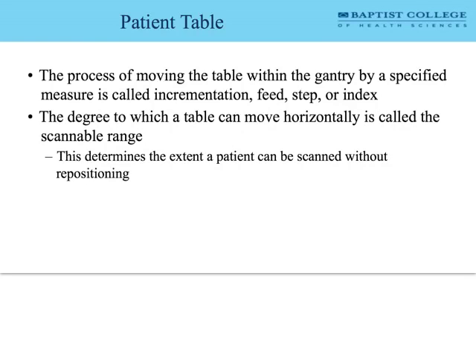But there's laser lights that converge on the patient. You can turn on the lasers, instruct the patient to close their eyes. I'm going to turn on some lasers, right? No one needs to be staring at lasers. You will then be able to see in 3 different directions where that ISO center is. So along the z-axis, along the y-axis, and along the x-axis, I can say the 0 point is right there. If I had a smoke machine, I could walk into the room and blow a lot of smoke in there and see right where all those lasers converge. That's what I'm lining up. I'm lining up the machine ISO center to the center of the patient.